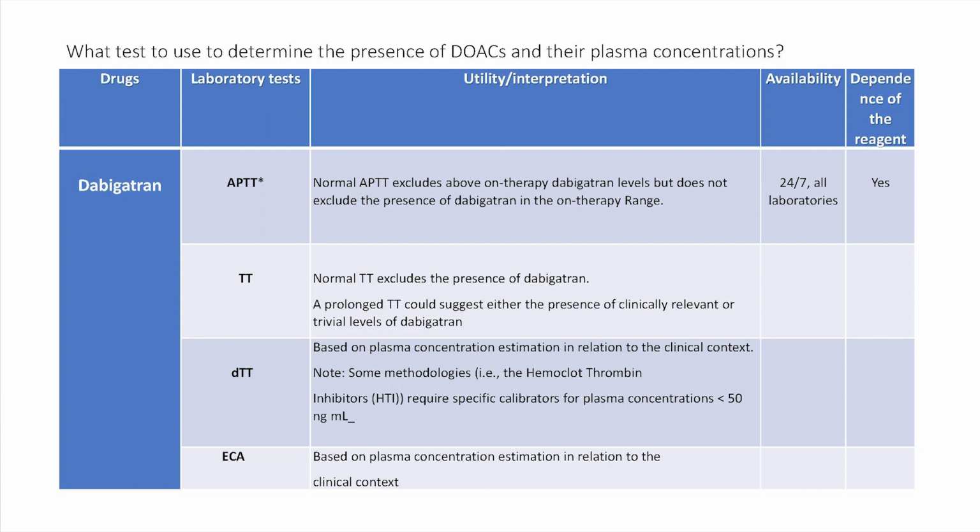The diluted thrombin test has an estimated relation to the clinical context. The ecarin test is plasma-based and also has a relation to the clinical context.